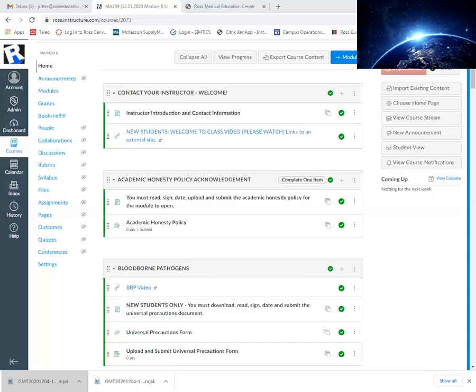Fake blood is not used at Ross. It is not necessary. These are practice draws, and water will give them the same feel as blood entering into the tube. The fake blood is costly and messy and clogs up the arms and is not an approved part of this program.